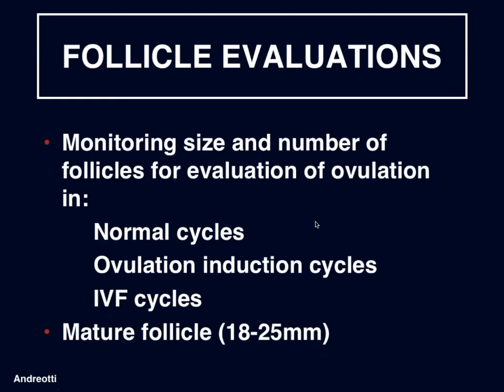So we can also perform follicle evaluations in which we monitor the size and number of follicles to evaluate for ovulation in patients just with normal cycles, with ovulation induction cycles, or with IVF cycles. And in these patients, we try to determine if there is a mature follicle that is available for ovulation.